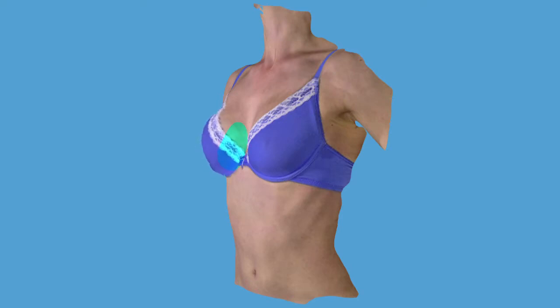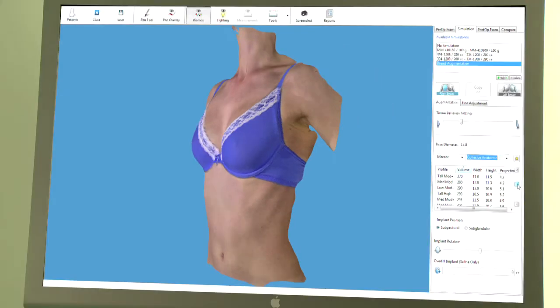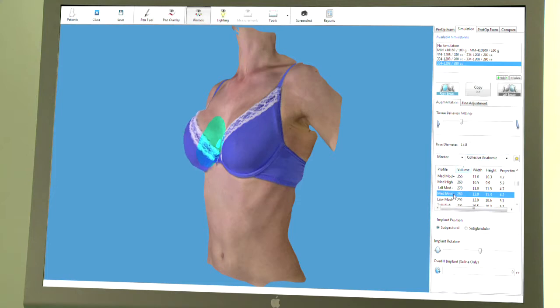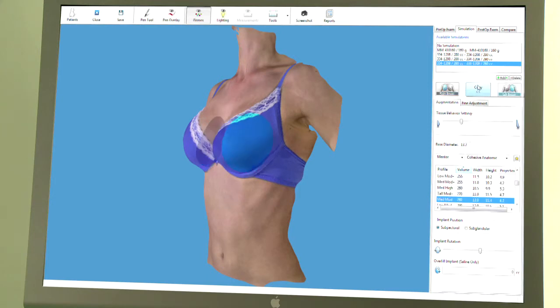When you start the simulation, our physics-based tissue behaviour simulation formulates the internal tissue structure of the breast. Developed with input from surgeons, TBS automatically defines skin elasticity, regions of muscle and glandular tissue to enable a simulation that reacts as the body would react, anatomically accurate and in real time.